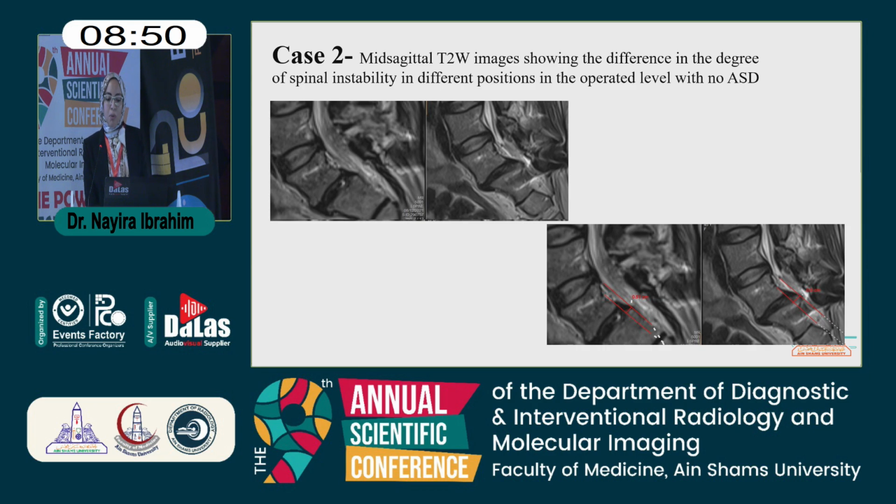Upon measuring the vertebral end plate, it was about 30 millimeters. The distance of displacement is more evident at flexion position, measuring about 9 millimeters, while measuring only about 5 millimeters in neutral position. Also in this case, the recommended management was fixation surgery. She wasn't compliant and her pain level worsened upon follow-up.